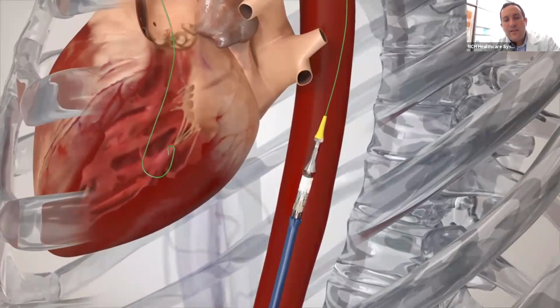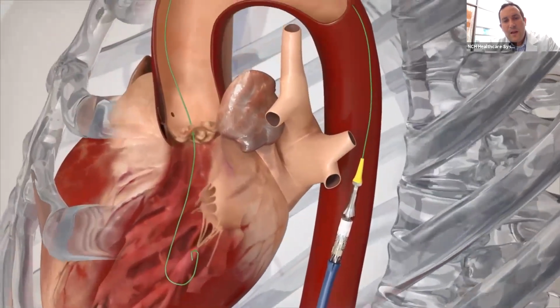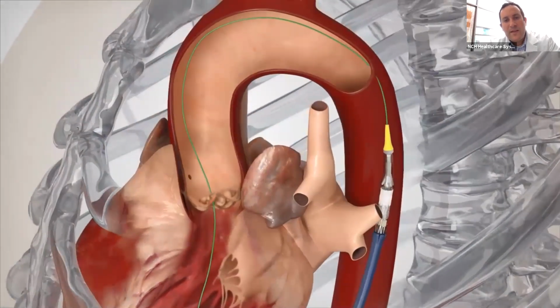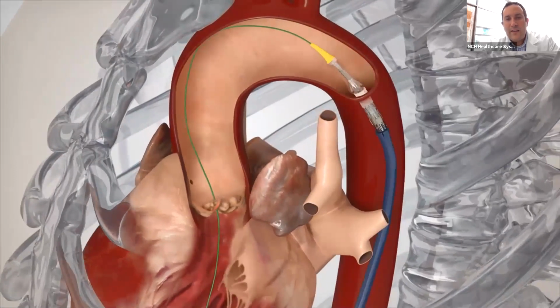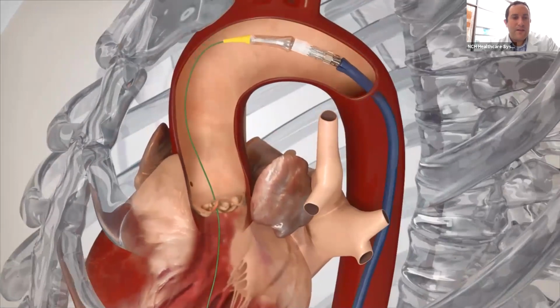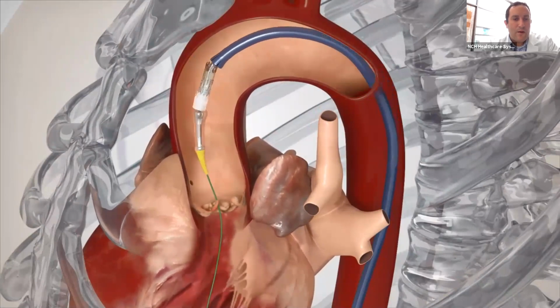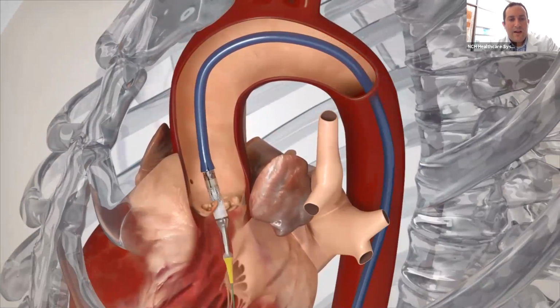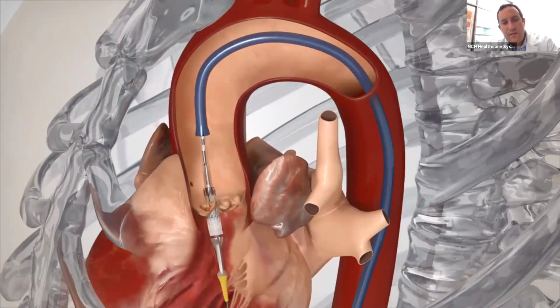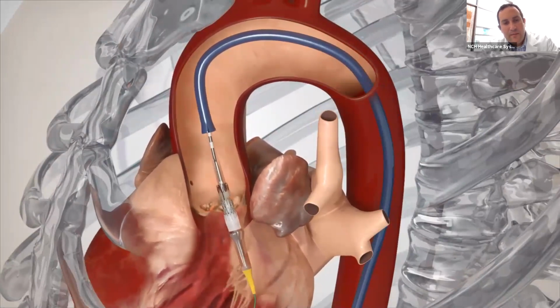So here we're measuring exactly how we place the balloon, and we're creating the system. And once it's created, we're going to come up and steer the valve over the aortic arch very carefully, making sure not to hit anything and not to scrape on the aorta and cause any damage. Once it's ready, we're going to bend that around the aorta and come into the valve, and we're going to use fluoroscopy, or a very high concentration X-ray, to make sure we're in the right position. We're going to unsheath the valve, and we're going to pace the heart again in about a second once the valve is positioned appropriately.